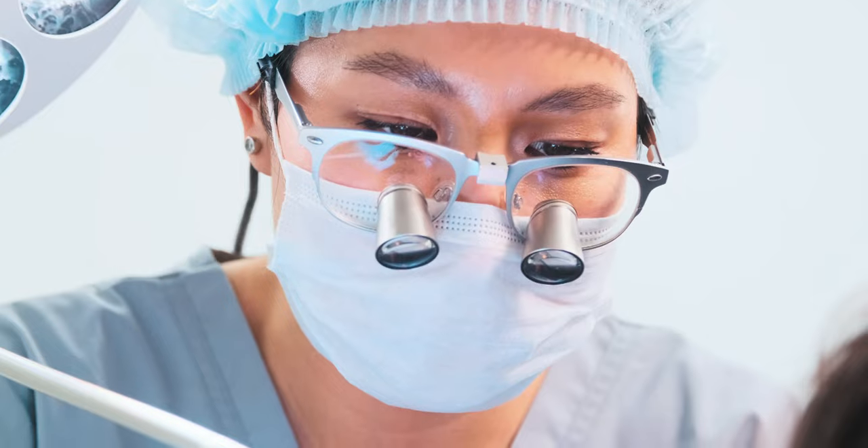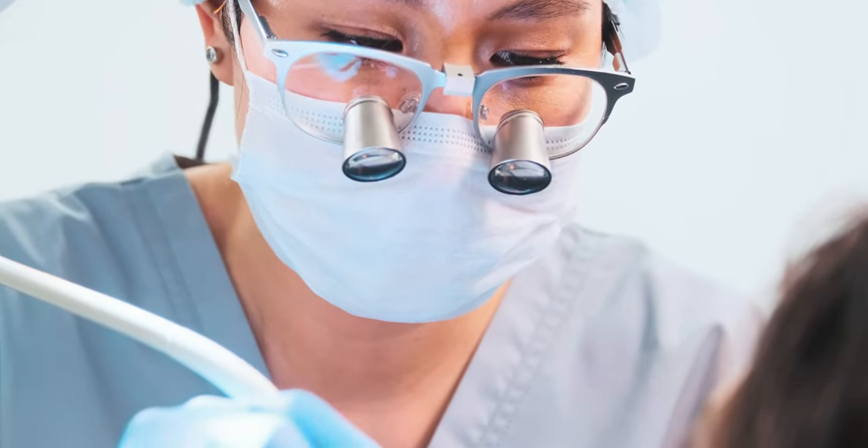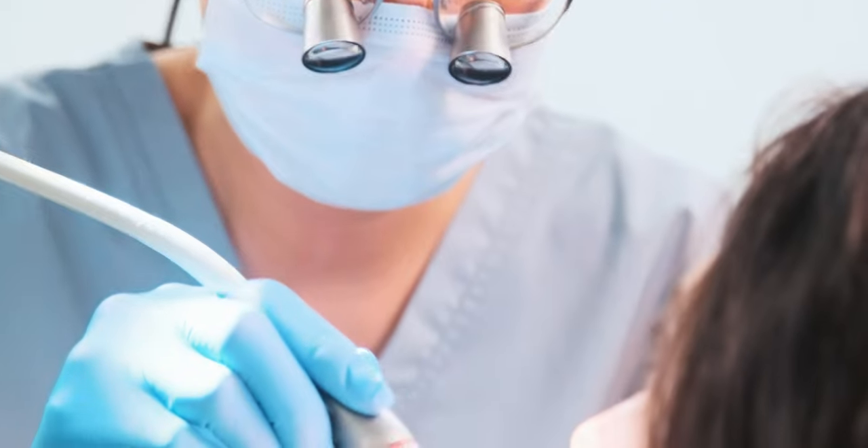Loops haven't always been insanely prevalent in dentistry, but in the last probably ten or so years they've become absolutely commonplace. Having done some dentistry without them and now with them, I can tell you that they are basically essential for anyone who is trying to do a good job when they're working in the mouth.